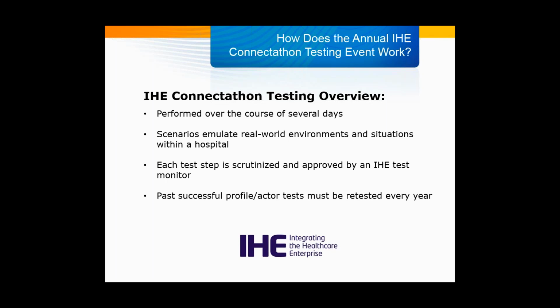There are other very important base kinds of tests, like Zach mentioned, with the synchronous time, to make sure that the devices and the gateways are synced to a common clock, so that when there is a time denoted in the message, it's actually meaningful. You often hear of a device that may be out of sync a week, a year, or sometimes since when it was first configured. And then recently here on the East Coast, when we turn back the clock in the fall, that can cause havoc with time synchronization.